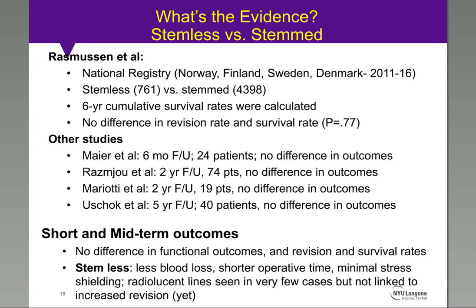The other studies are relatively short-term follow-up, but in stemless and stem designs, and none of them have shown any significant difference in the revision rate or survival rate for these components. Stemless designs are definitely associated with less blood loss because they do not encroach onto the medullary canal. They have shorter operative times and less proximal shielding.